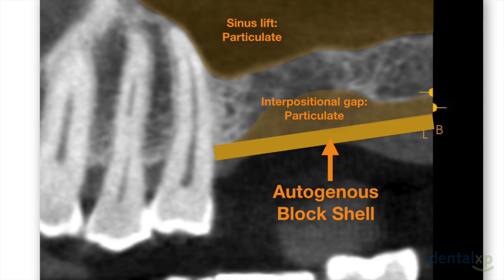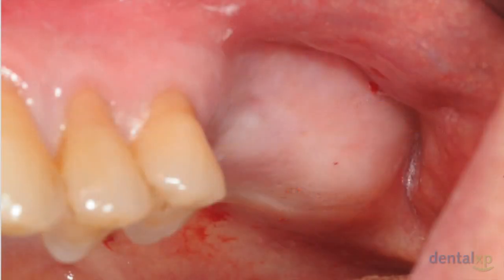The critical factor for success in this technique is presence of an adequate amount of soft tissue and a thick biotype for proper closure. So if necessary, a connective tissue graft may be done initially to create a thicker biotype, allow it to heal for about 6 to 8 weeks, and then perform the bone augmentation. In this patient, we had a rather thick tissue biotype and adequate amount of tissue for flap advancement and repositioning, hence the connective tissue graft was not necessary.